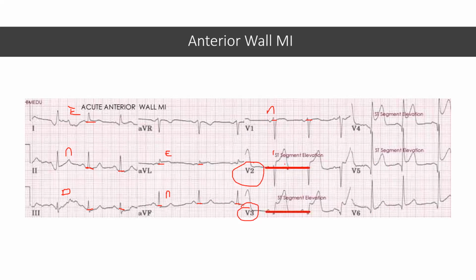It's more than 2 millimeters. We also have V4. How about V5? Okay. And how about V6? It's only 1 millimeter.